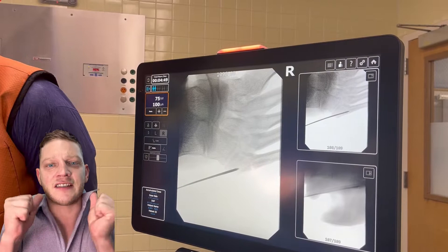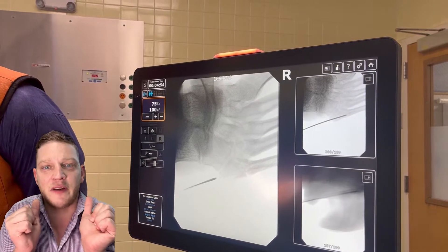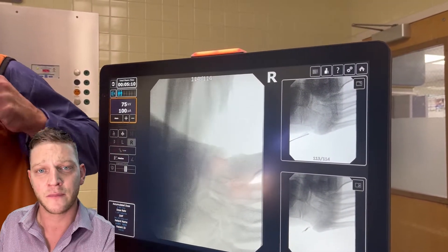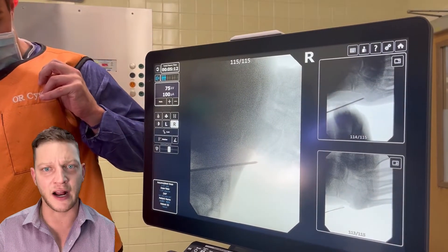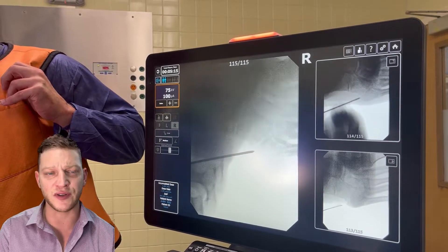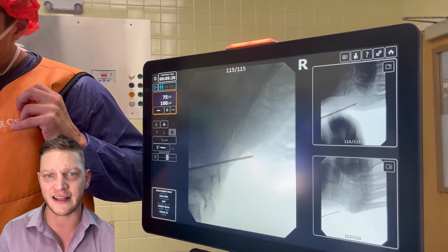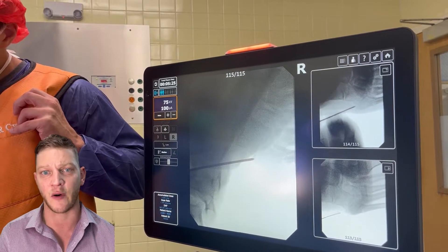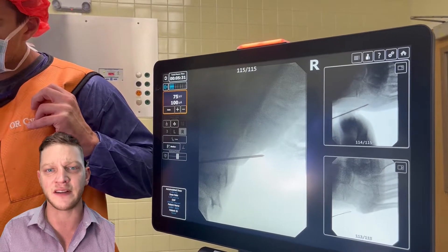You can see he's covering his neck with that orange lead because he doesn't have a thyroid shield — when the x-ray is going off he's exposed to so much radiation he doesn't want his thyroid to get cancer. You can also see my hands in the x-ray right here. My hands get exposed to a lot of x-rays during these minimally invasive procedures. There are case studies of orthopedic surgeons in their 70s and 80s who get carcinomas on their hands from all the radiation exposure.